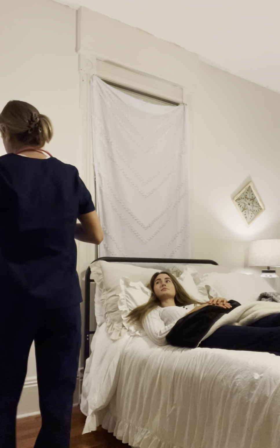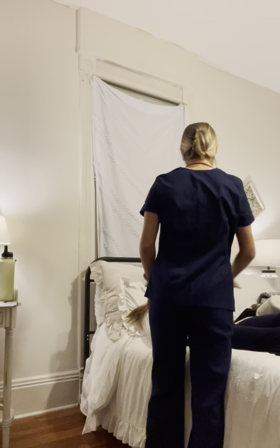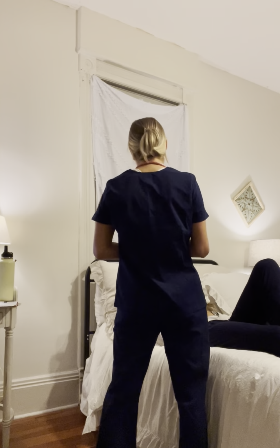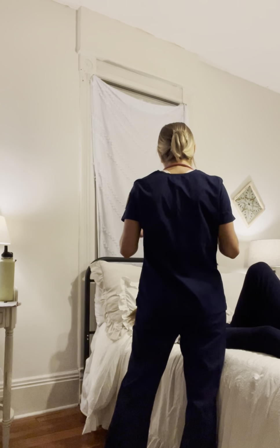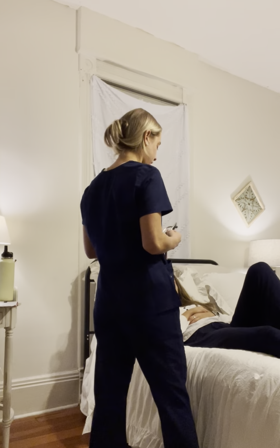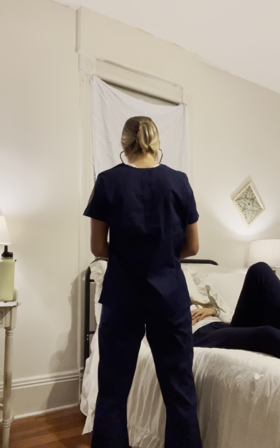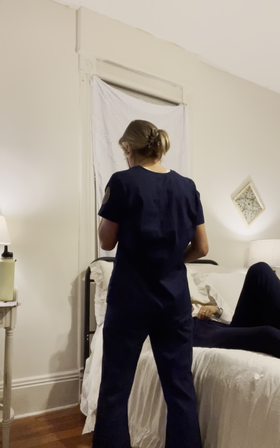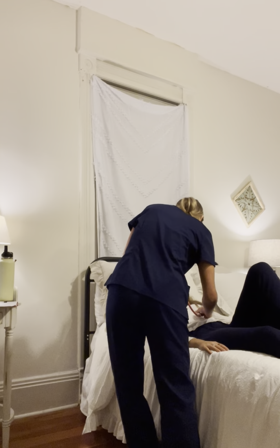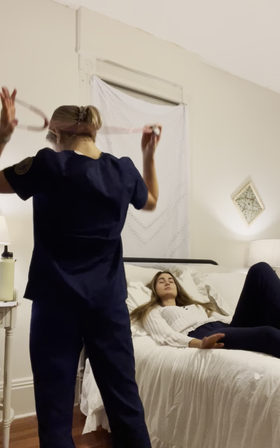Now I'm going to inspect the abdomen for any pulsations. So we would assume that I checked under the patient's gown and inspected their abdomen, and I detected no abnormalities, no pulsations from the abdominal aorta or anything like that. Now I'm going to auscultate above the umbilicus with the diaphragm and the bell to listen to the aorta and the abdomen. With the bell, diaphragm. Okay, no abnormalities detected.